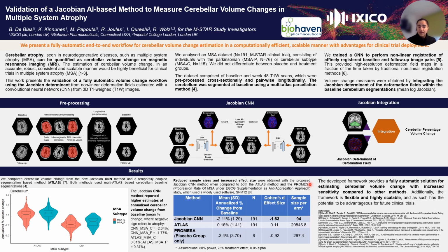So in summary, the developed framework provides a fully automated solution for estimating cerebellar volume change with increased sensitivity compared to other currently used methods. In addition, this framework is really flexible and highly scalable and produces volume change estimates within a fraction of the time. It is therefore suitable for clinical trials, both large and small, in MSA and other neurodegenerative diseases where the cerebellum might be of interest.